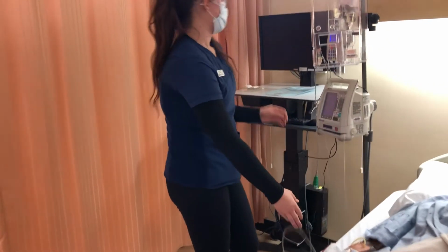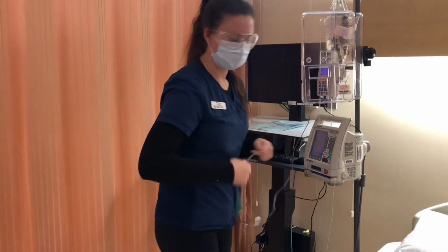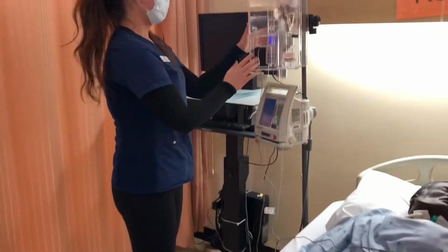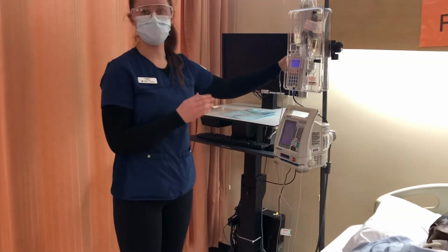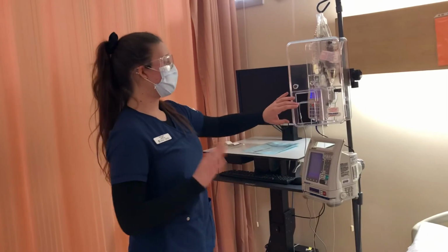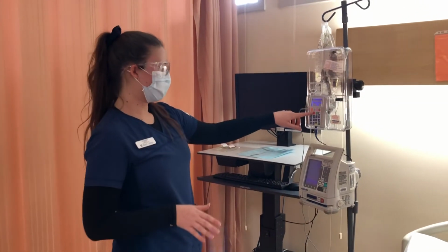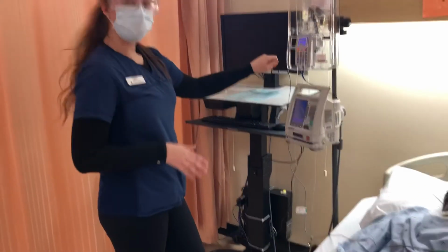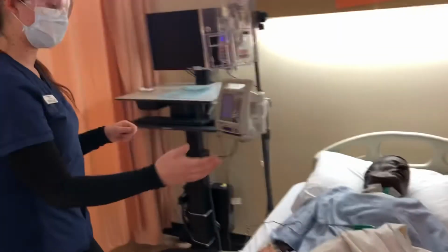And they are, so I'm going to make sure that the PCA button is within reach of the patient so they can access it when they need it. This is locked, so I'm going to begin my exit safety check. The TKVO, all of the clamps are open, and that is infusing appropriately. The PCA, all of the clamps are open, and that is infusing appropriately. I know because of the green flashing light, it is locked, and the button is within reach of the patient here. The call bell is within reach of the patient.